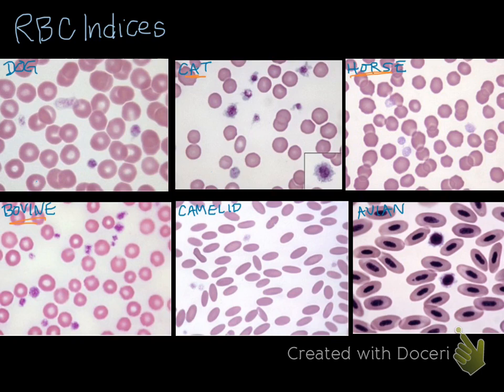Cows are similar to dogs in that they have central pallor, but the cells are a little bit smaller. And for that matter, goats and sheep, different types of ruminants, also have very minimal central pallor, but their red cells are very, very small. They're some of the smallest red blood cells. Camelids have elliptical red blood cells, which is very interesting. It just means that it's hard to do some of the standard blood assessments that we do on hematology analyzers because of the shape, and that's true of birds and reptiles as well, who have the weird shape and that are nucleated.